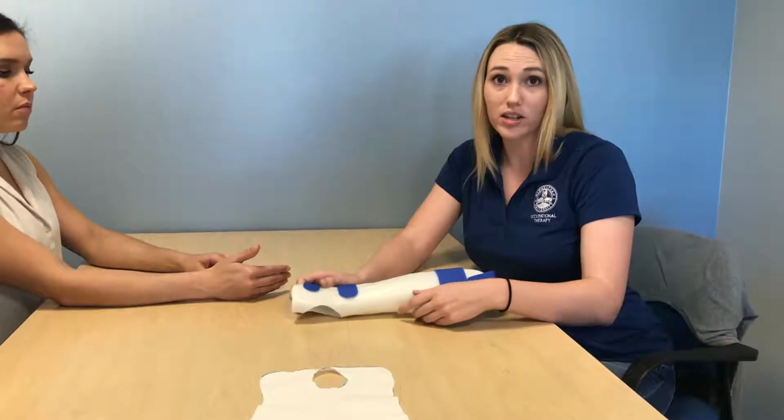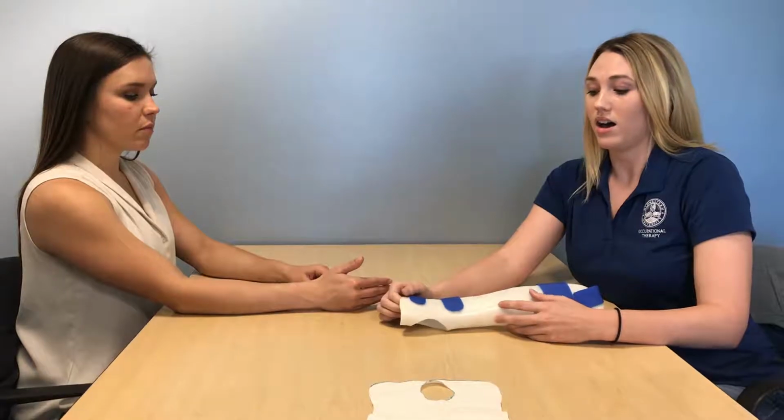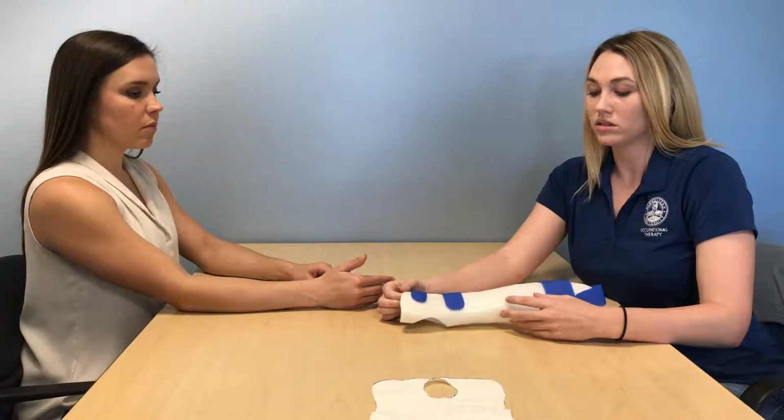It has great memory, so it's easy to remold. It's not perforated, which makes it a little more durable. Also, thickness makes it a little more durable since we're including multiple joints. It's very easy to stretch this material, so that also makes it a little bit easier to work with.